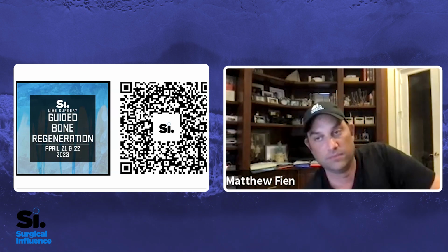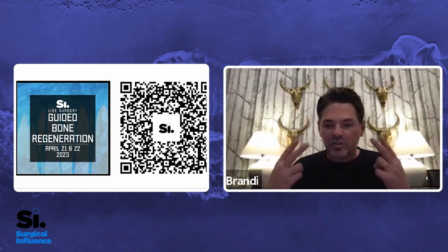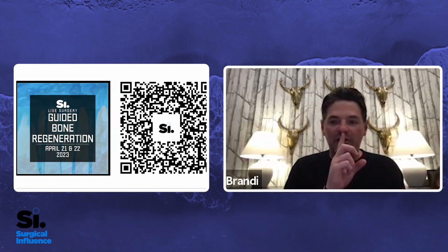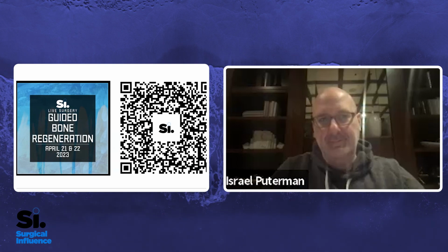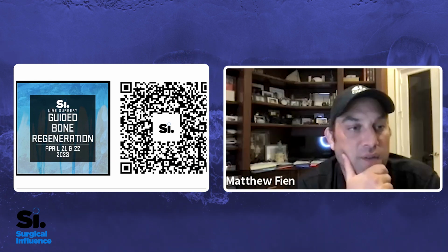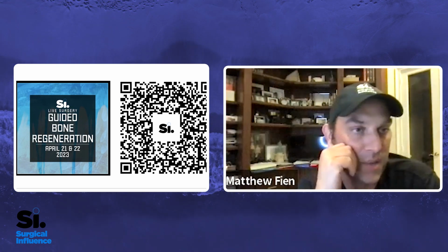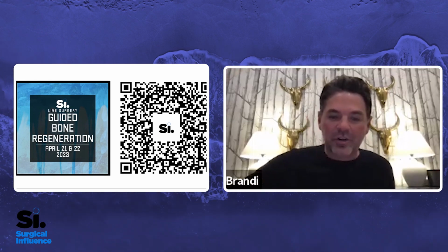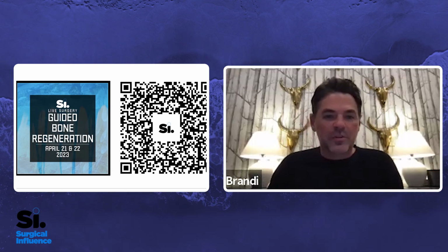But I love the way you approach that, Matt, utilizing the anterior segment and basically treating it as two defects, because of the anterior nasal spine, you set yourself up to go right and left and build up that bone the way you guys did. I think it's completely successful. I've always imagined a way to trim the membrane so you can get it around the curve, but I'm just not really good with paper mache or whatever that craft is. So that's definitely a good way to go. That's the way I do it too, you treat it as two separate defects, and that's the most successful way.